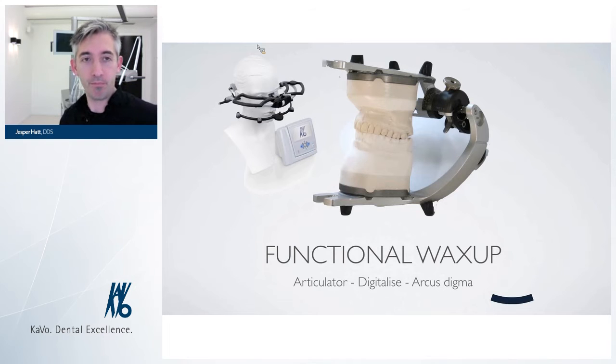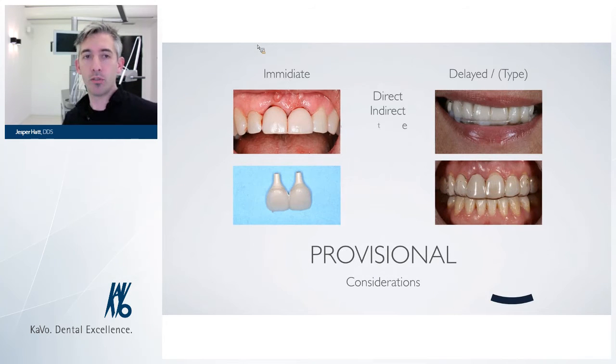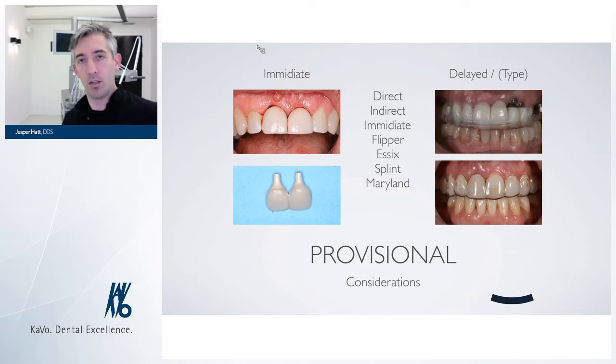So when we have a plan in place, we start to make some considerations. Are we going to do some kind of immediate provisionalization, either direct or indirect? Or are we going to delay the pressure on the implants, the final restoration? Are we going to delay any kind of pressure to the implants?